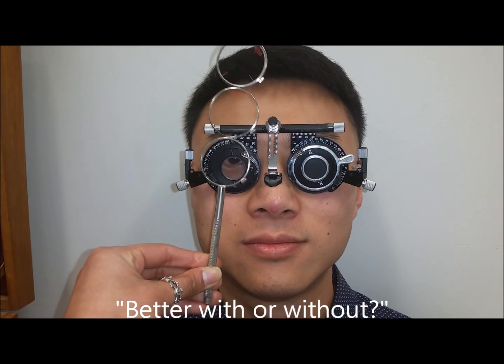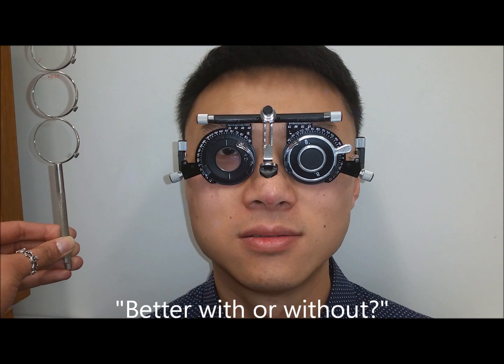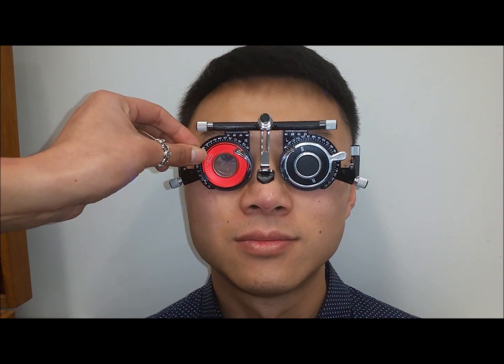The patient's vision did not improve with the plus lens, therefore the minus lens will now be tested. Yep, and just tell me again the same thing. Is it better with or without the lens? With the lens. Because the patient preferred the minus correction, the orthoptist will place the minus 0.5 lens into the trial frame and then continue to see if the patient requires further correction.